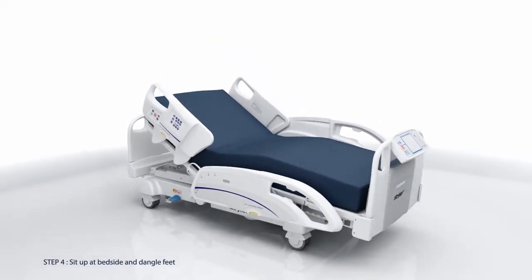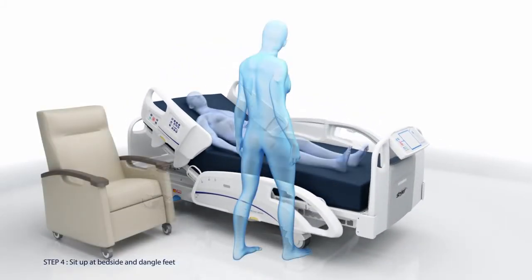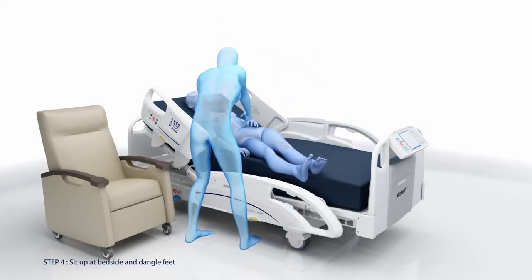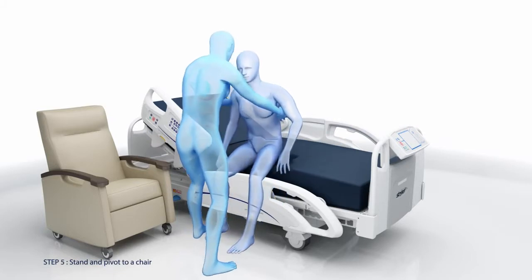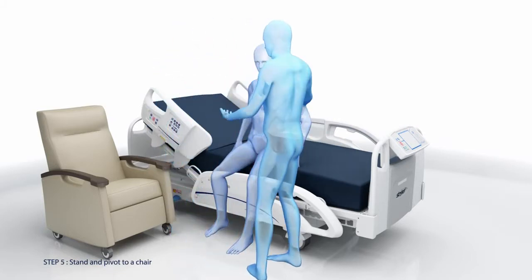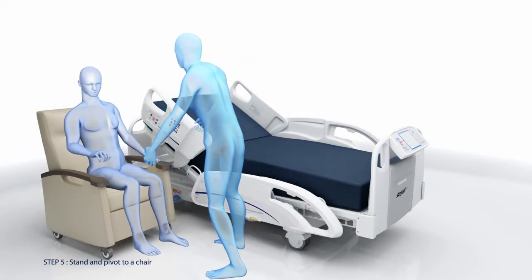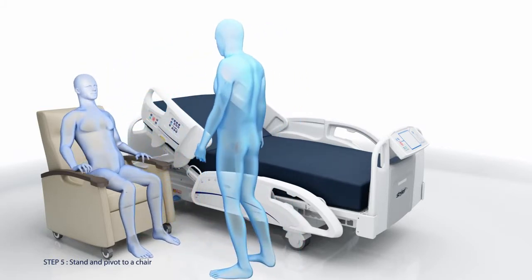In Step 4, the goal is to sit up at bedside and dangle with feet on the floor. Patients can then progress to standing at bedside. Step 5 is the final step where the patient will be aided to a standing position and then pivoted into a chair. This will engage all muscle groups and aid in systemic cardiovascular adjustments. This can assist in the patient's overall psychological status as well as their physiological status because of the body's response to movement against gravity and the patient's progression back toward his or her baseline.